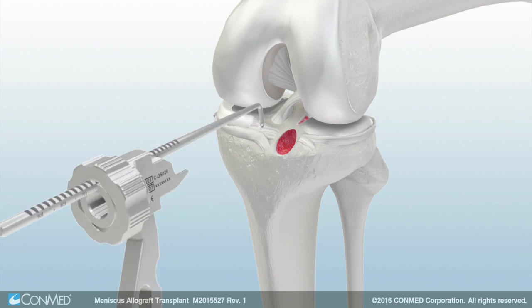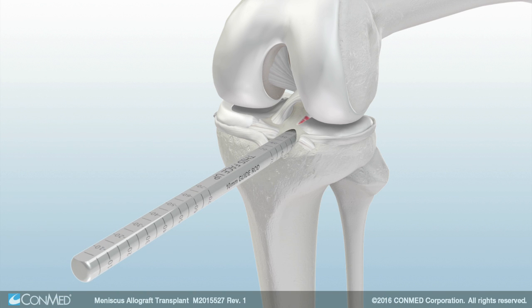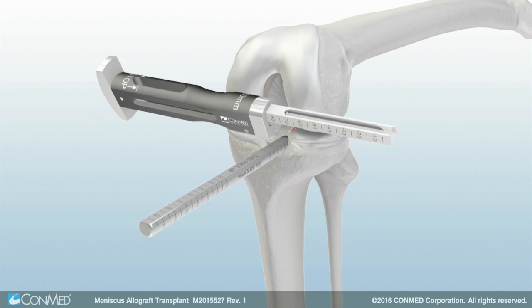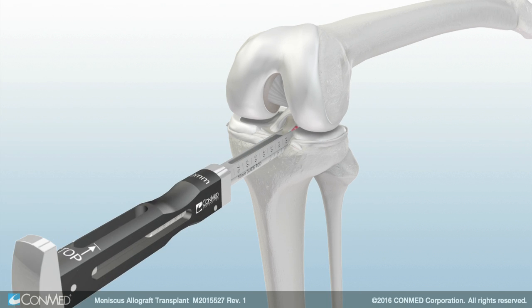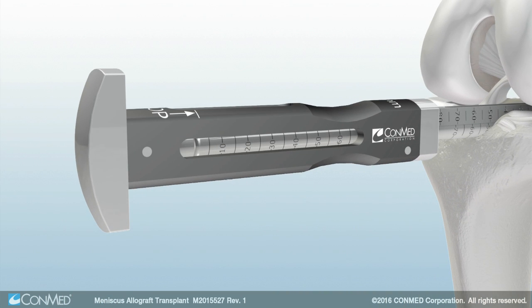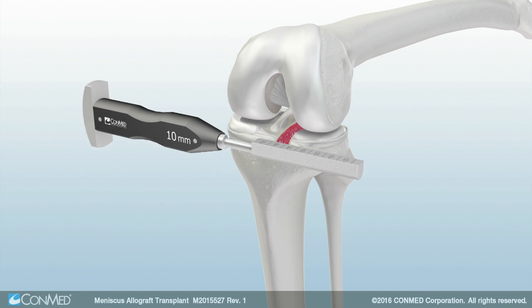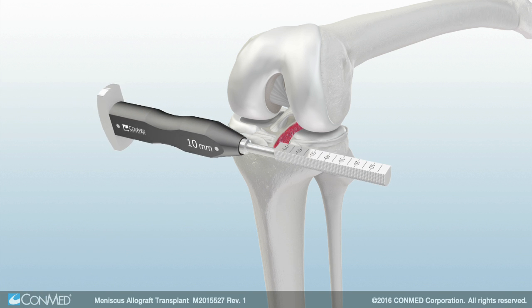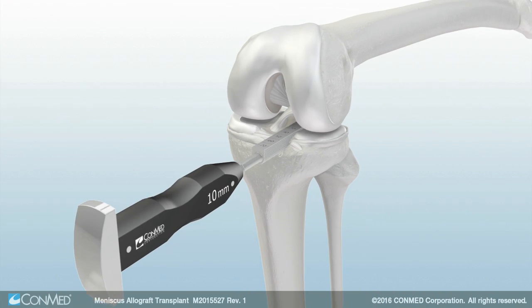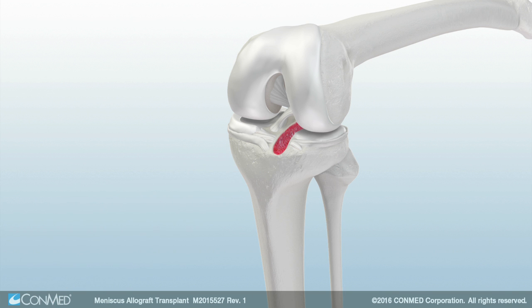Then insert the guide rod into the tunnel until it contacts the posterior tibial cortex. Align the chisel over the guide rod and gently tap the chisel until the depth stop is engaged. Remove both the chisel and the guide rod from the joint. Then insert the rasp into the trough and assess the fit of the rasp within the trough. Utilize the rasp to remove residual articular cartilage if necessary.